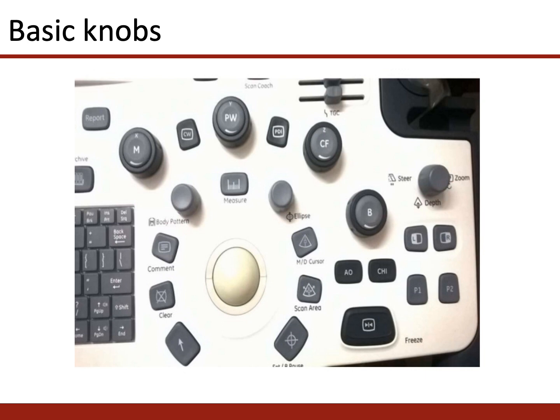That button is used when using it for an echo. We can also freeze the image. We can see that button on the bottom right. We can measure, so that's particularly useful if we're using this to image for epidurals or spinals. And then we can flip the image left or right, and those two buttons are located just below the depth button.